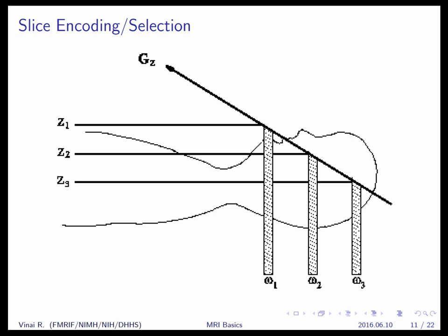So basically, during RF transmission or excitation, you give an RF pulse of a particular frequency. Because of resonance, the pulse will essentially extend over the entire imaging volume that the coil can transmit to. But because of this gradient and because of resonance, it is only going to excite the protons in the slab that matches that frequency into this excited or higher energy state.